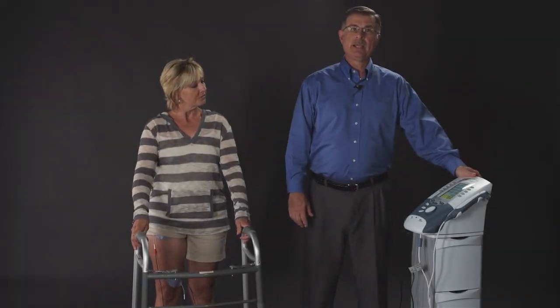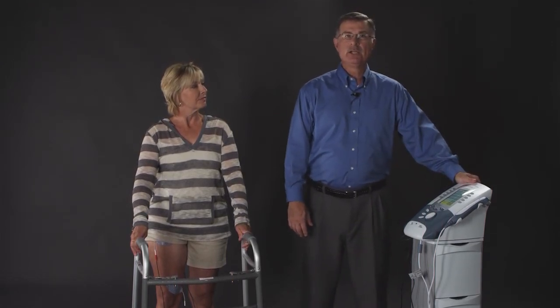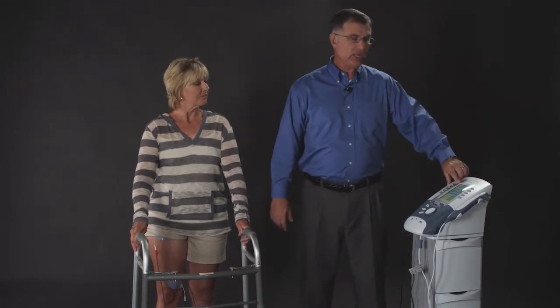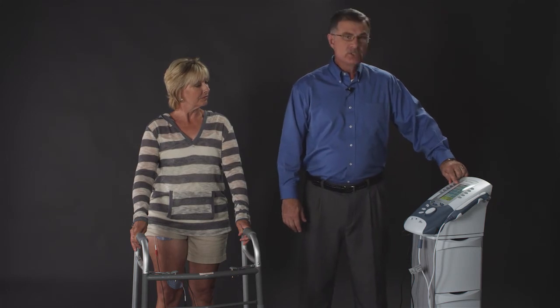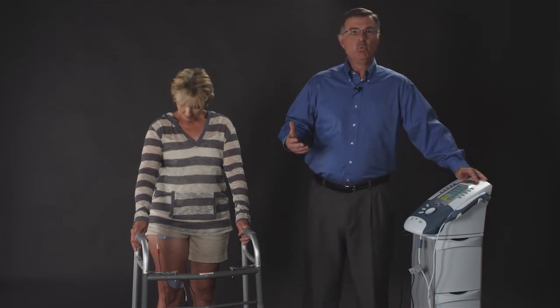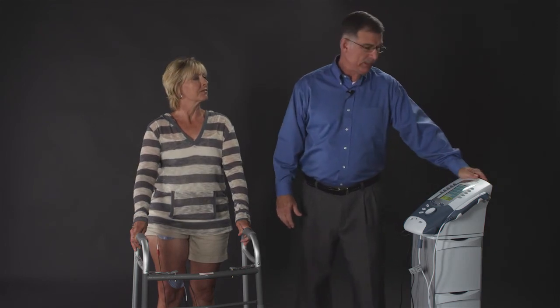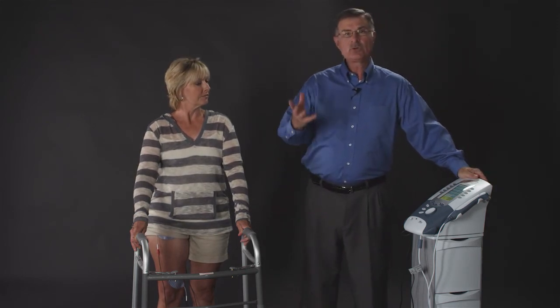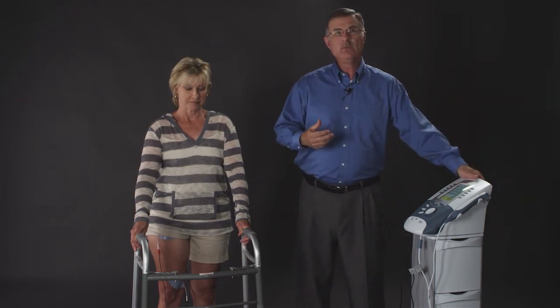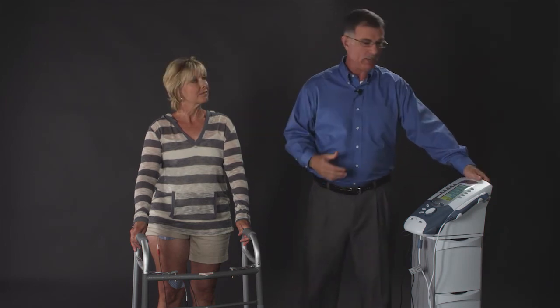Now let's show another application with VMS. In this case, we're going to try to create stabilization in a weight-bearing activity with our patient. The first thing I'm going to do with the unit is change the channel mode to co-contract so that I can contract two muscle groups at the same time. If you'll notice, there is one channel that has been placed on the quadriceps. We have placed a second channel on the hamstrings. We're now going to contract both of those at the same time and ask our patient to shift her weight to the surgical leg when the muscles contract, creating the stabilization of the hip and the knee.